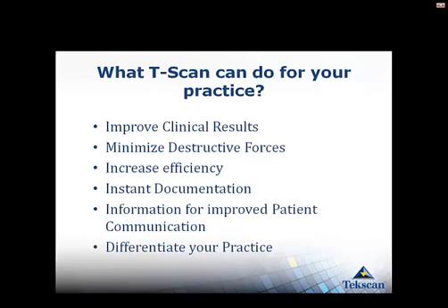And so what our doctors tell us that TScan can do and does for their practices is they tell us it increases their efficiency. I think that's probably the most important there, along with improving their clinical results. And obviously, it will also differentiate your practice.